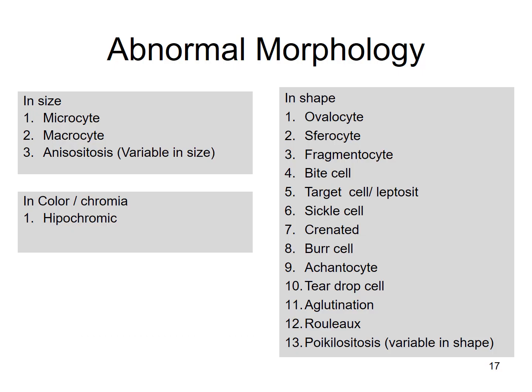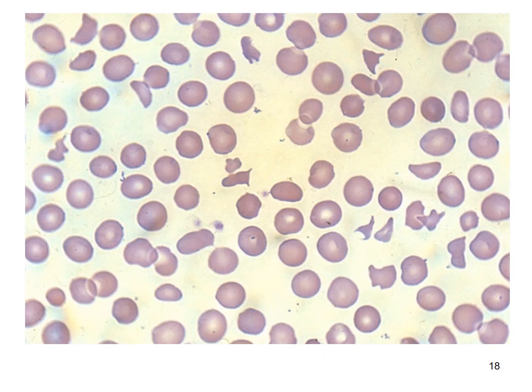There are many various abnormal morphologies of erythrocytes. These red arrows point to fragmentocytes.